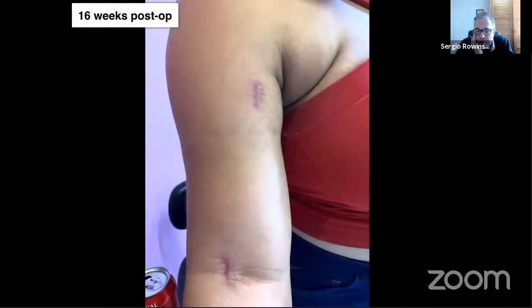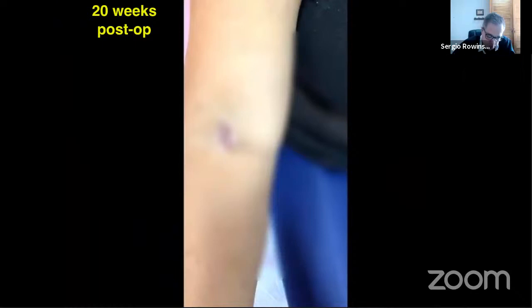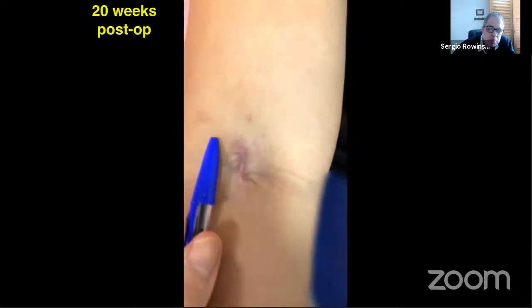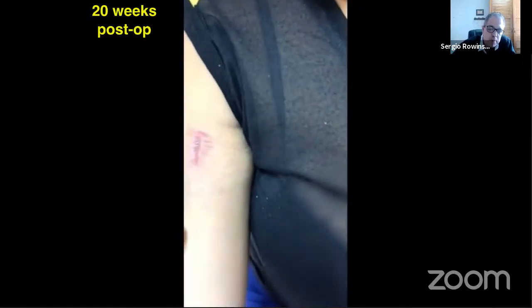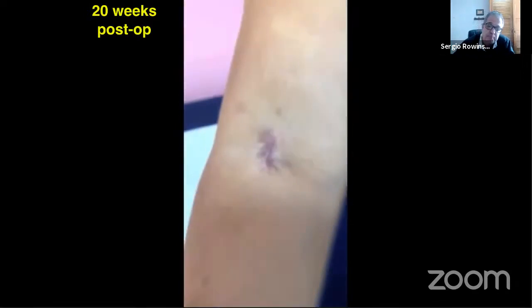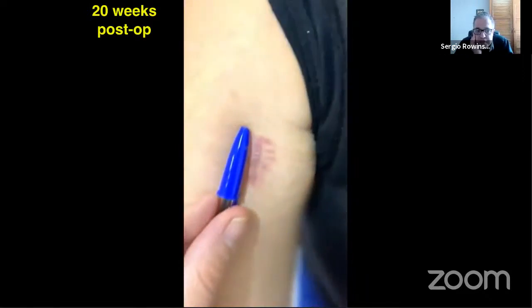So I would like you, my friends, to think about these incisions and think about the gigantic approach posteriorly. And this is why I call this a revolution. 20 weeks post-op, see the size of the incision, extremely small. This is not percutaneous, this is MIPO. Compare it with a posterior approach, incomparable. I consider this revolutionary. Let's see the motion of the lady after 5 months.